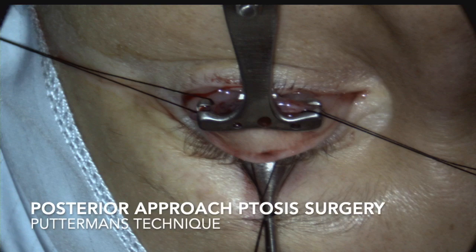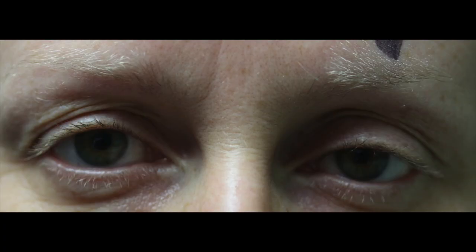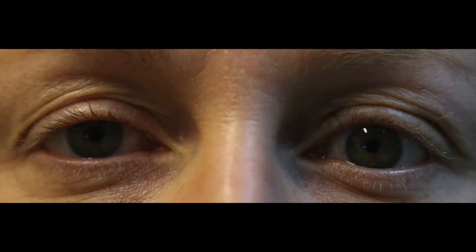Putterman's technique is a relatively quick method of posterior ptosis surgery. It is often used for mild ptosis with good levator function and typically maintains a good lid contour postoperatively.